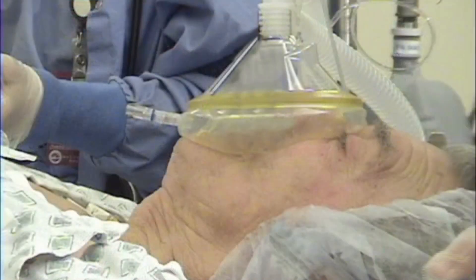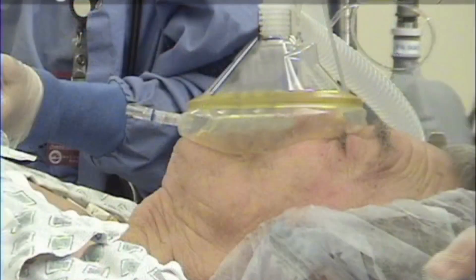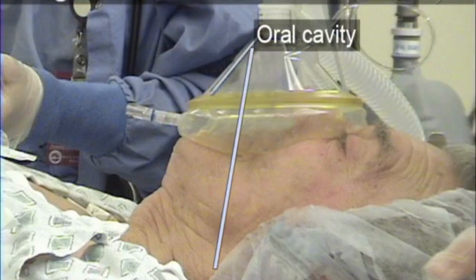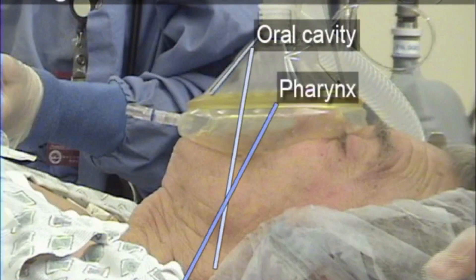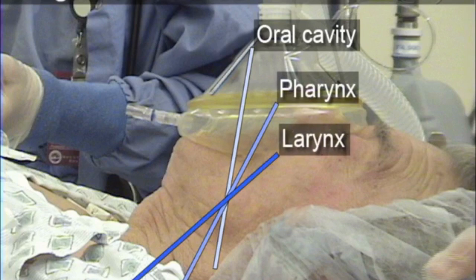This combination of flexion of the neck and extension of the head improves the alignment of the axis of the oral cavity, pharynx, and larynx, facilitating optimal visualization of the vocal cords.